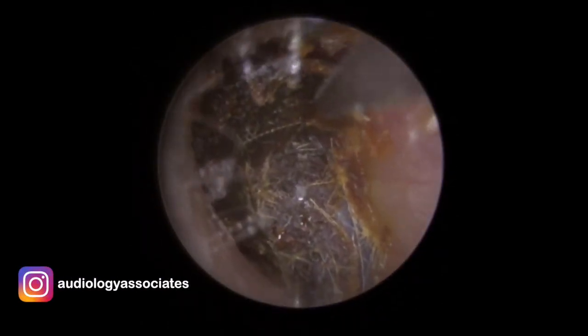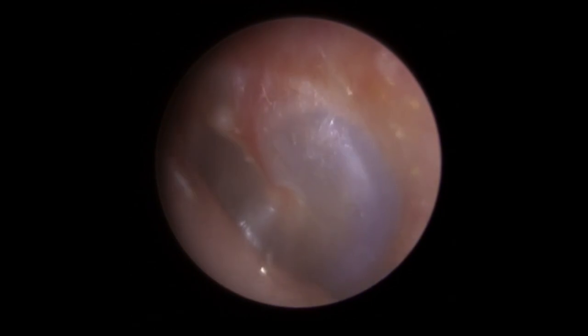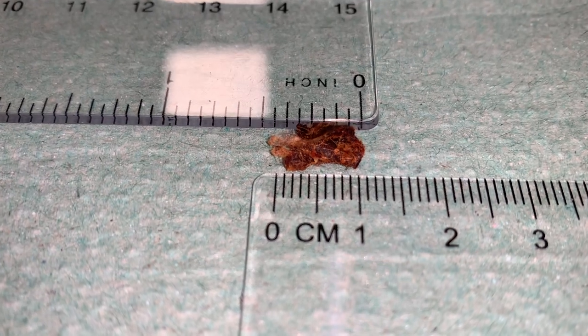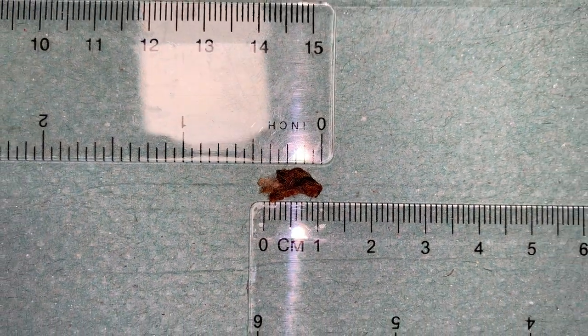Let's use the forceps again and see if we can get in there because the jaw of the forcep is slightly thinner. We're trying to get a grip above and below — just slowing this down so you can see what happens. There we go, we've got the grip. Look as we pull this away — it's been so compressed together with the Q-tip that it's formed one solid block that's dried out and has been sitting on top of that eardrum. Let's come away and take a look behind. We've managed to take every single piece of wax — all the bits that were stuck around the edge were all connected to that one piece. It's a centimetre across, almost bang on half an inch — quite a substantial piece to be pressed up against your eardrum.